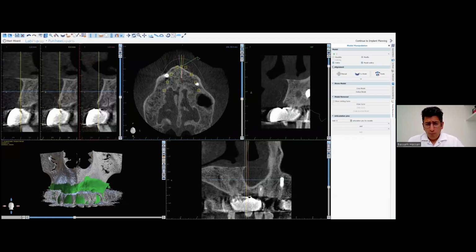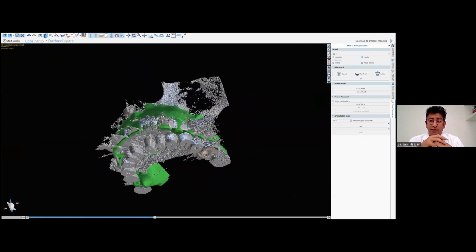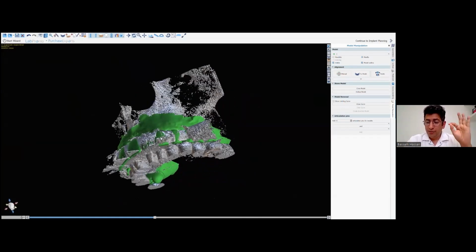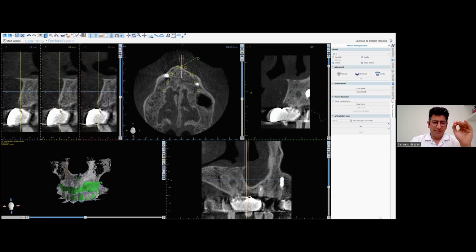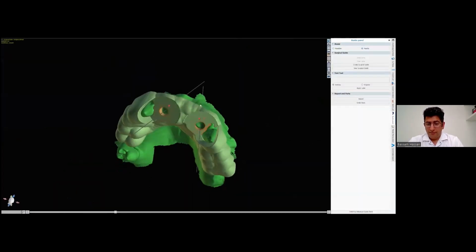Why? Because I'm using a very short scan time. I'm using 8 or 9 seconds, because I'm using 180 degree scanning, not 360 degree scanning. I'm using a half field of view. When I press the button, I instruct the patient, please hold your breath, because your biggest enemy in cone beam is motion artifacts. It is not voxel size, not pixels, nothing else. And then you see, once we did the segmentation, everything else falls into place.